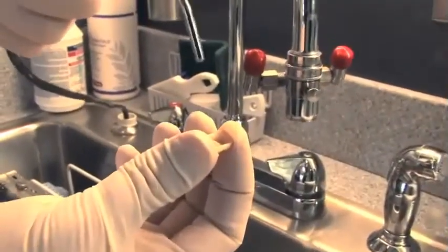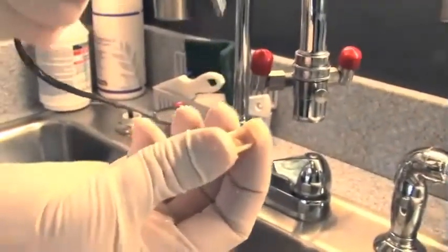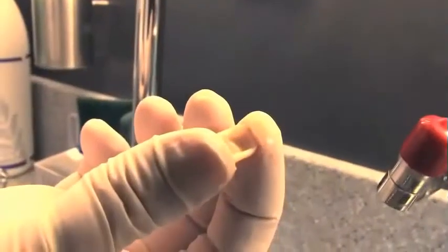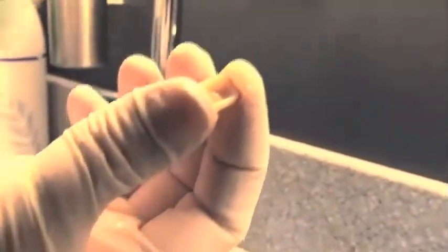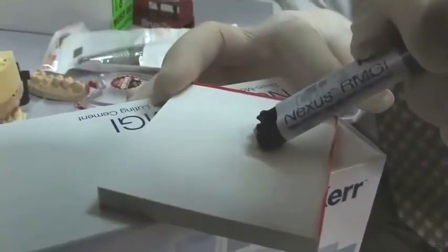Then we rinse those out and dry it off, and now we have a fresh bonding surface. I'm going to place a drop of zirconia primer in there, wait 30 seconds. The reaction between the phosphates and the zirconia primer and the zirconia oxide in the crown creates a little bit of water, and that's what we're doing with the air — blowing that out of there.